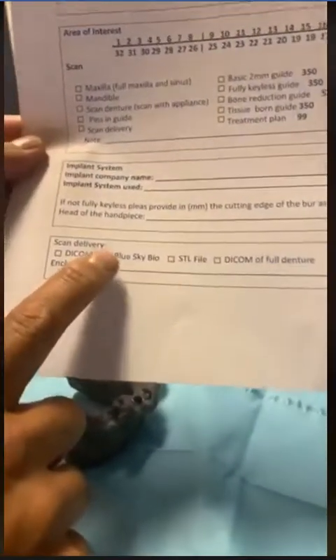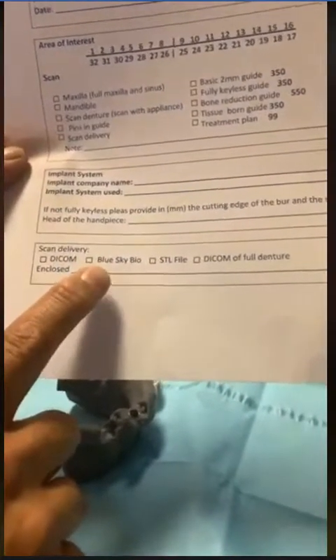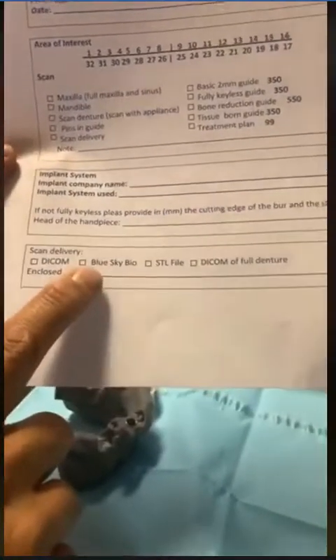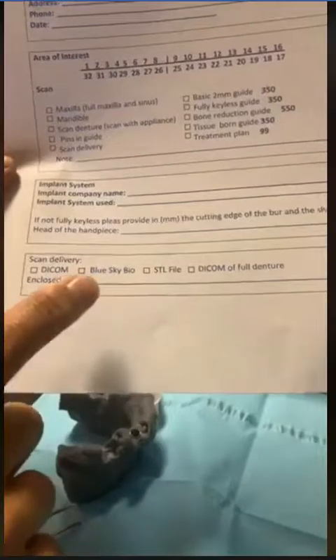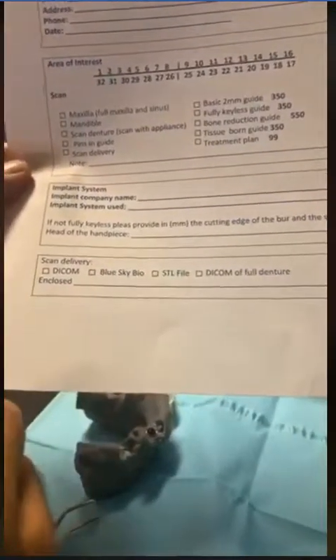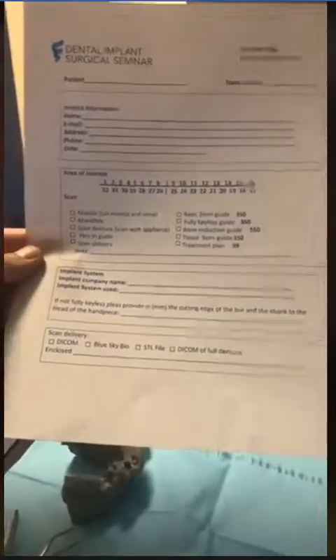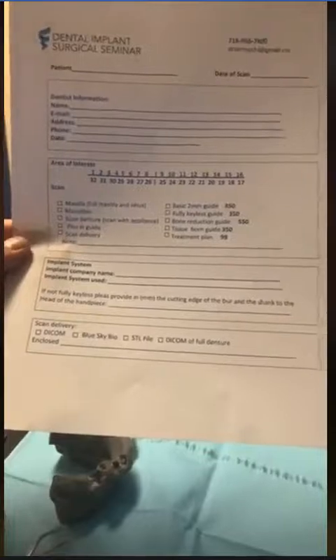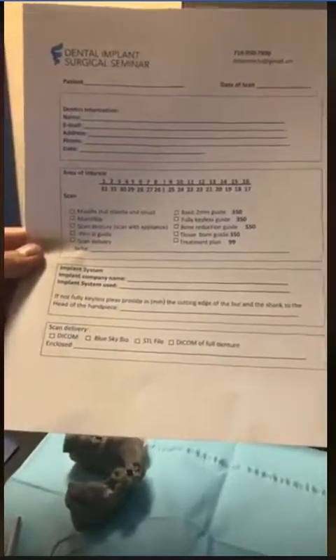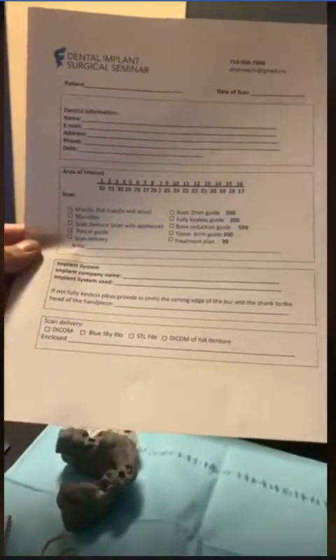Then on the very bottom over here, I ask, is it a DICOM? You can certainly go ahead, and it's a free app. I apologize, not an app, but a program from Blue Sky Bio. Sign up with them, and you could get a code, and you put it in there and actually be able to use their system. So we're going to need some STL files, DICOM, and all those things can be done really with Parse Dental Lab with Mr. Kurosh. If you live in Houston and you want to use our services, and this is really geared towards you guys because we are basically doing this on a Parse Dental Lab site.